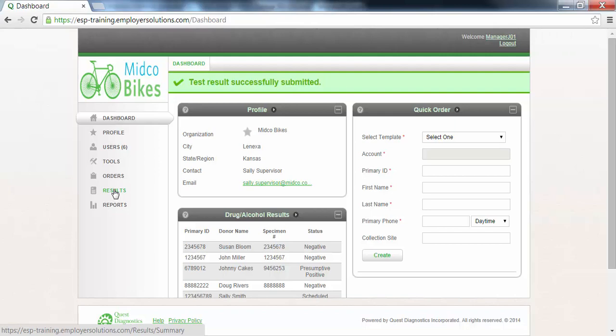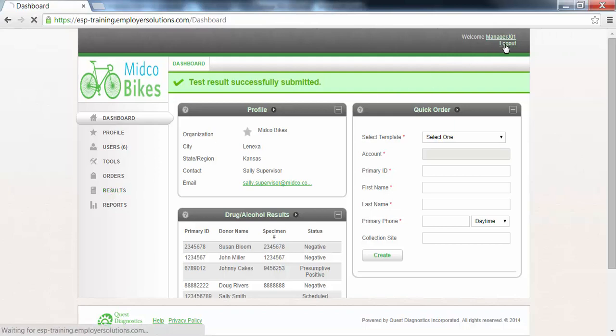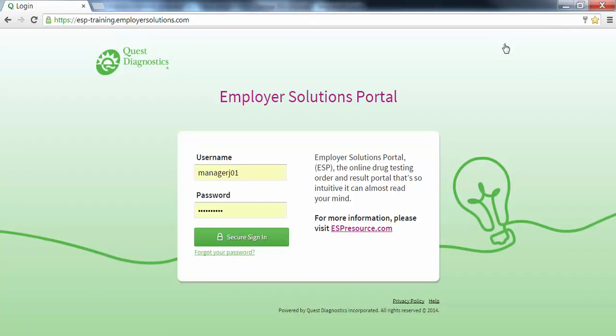The enter instant result function in ESP allows you to manage your drug testing program using an instant test device and record results for viewing in the future. This completes the employer solutions portal online tutorial. Thank you.